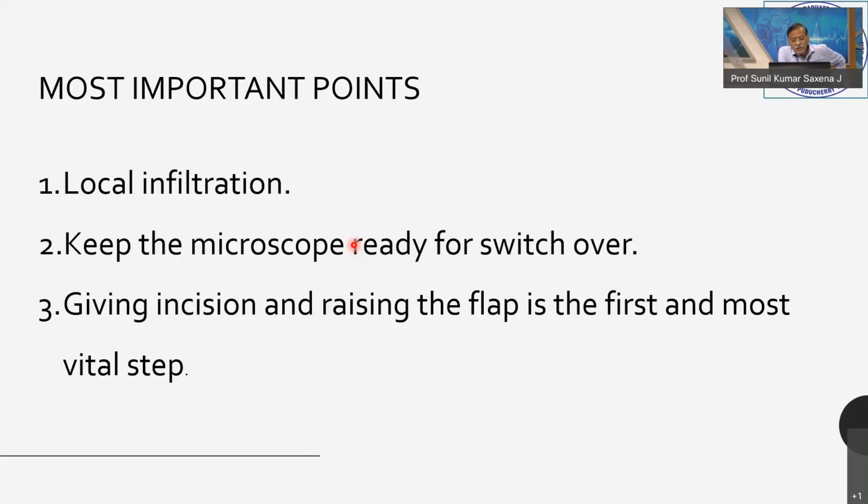The next important step is incision and raising the flap. This is the first and the most vital step, because this is the step in which bleeding starts, and it becomes very, very difficult when too much bleeding is there. So you have to be careful when you are raising this flap. I will tell you all the points, how to raise the flap and what points you have to keep in mind, when I show you my operative video, in which I will tell you each point. I have a few videos as well.